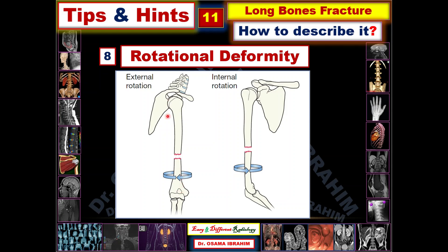This is an external rotation because it is rotated externally. In another example of the shoulder joint examined in the AP view, if you look at the distal joint of the elbow you can see it in the lateral view, indicating internal rotation. According to the direction — internal or external — you can describe it accordingly. If you have both the proximal and distal joints of the long bone in view, you can discriminate whether there is external or internal rotation. These are the eight items you should describe when facing long bone fractures.